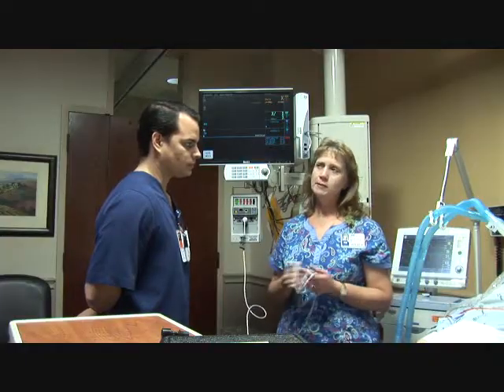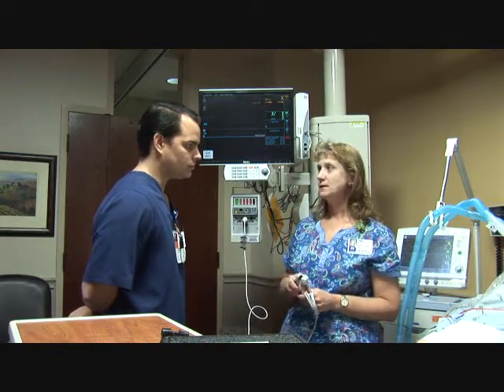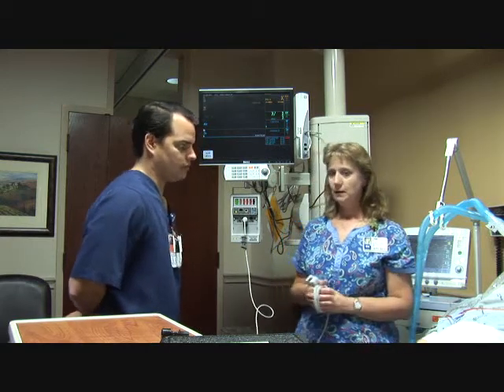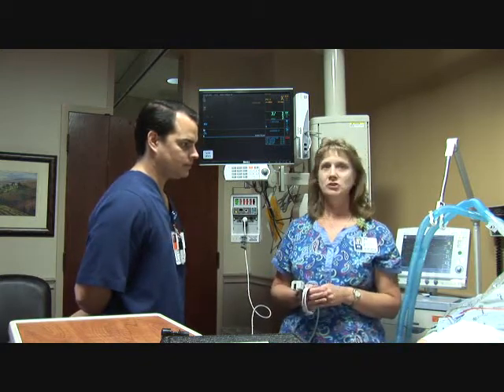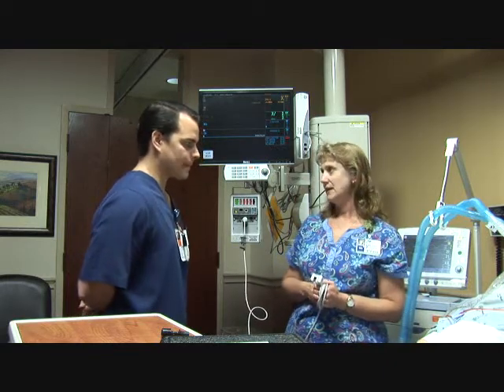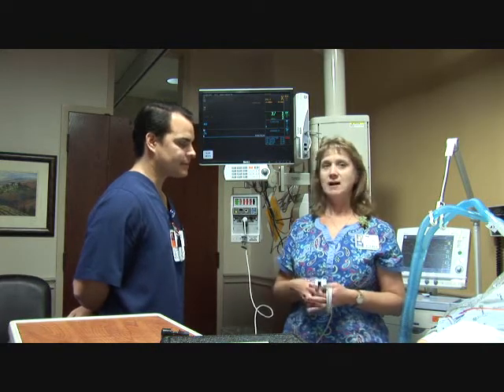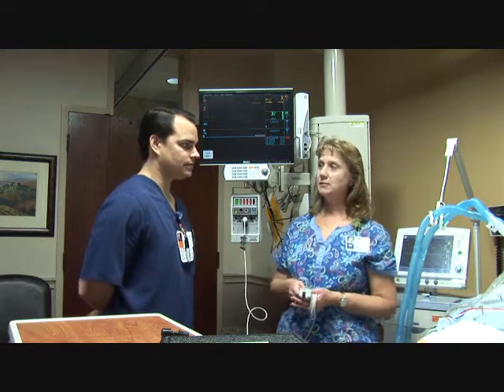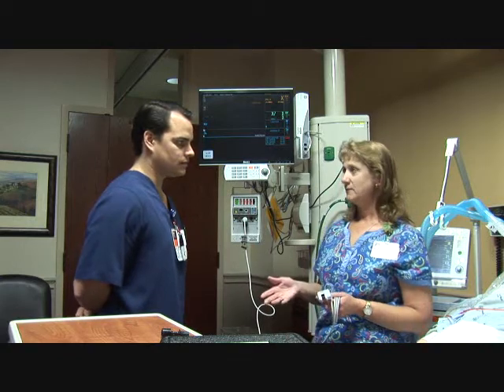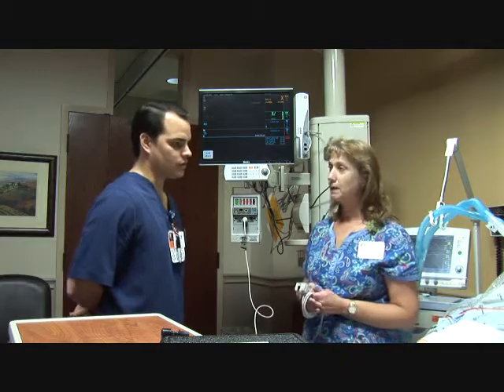Do you know what type of patients we may use End Tidal CO2 on? No, I'm not sure, but can you tell me? Sometimes we have patients come in from surgery, and they have been sedated quite a bit. So we want to make sure that their ventilation drive is not down, and we can tell sometimes by the waveform if they're coming out of sedation, and when that occurs, then we can start extubating them. Okay.